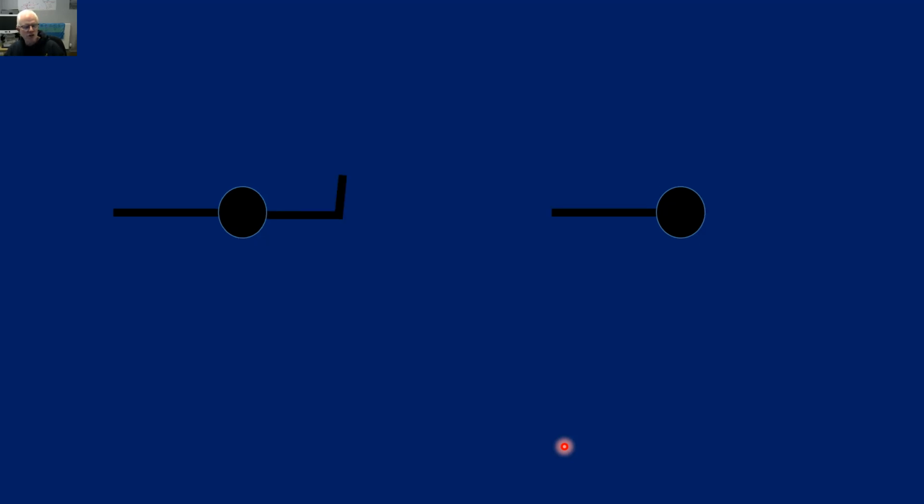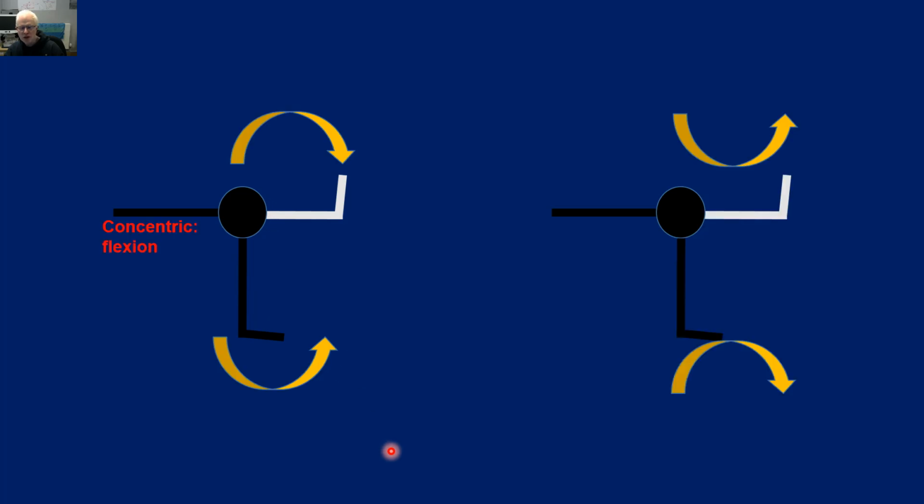But when we then get into going from flexion to extension, notice the way the forces are being applied. In this example, the dynamometer arm is trying to accelerate the limb back to flexion. The participant is trying to put the braking force on. In this example here, the limb is falling. So the participant is going to apply the force to try and pull it back as quickly as possible. The dynamometer is going to pull in the opposite direction. So this becomes the braking force and therefore creates the muscle under that state of elongation.